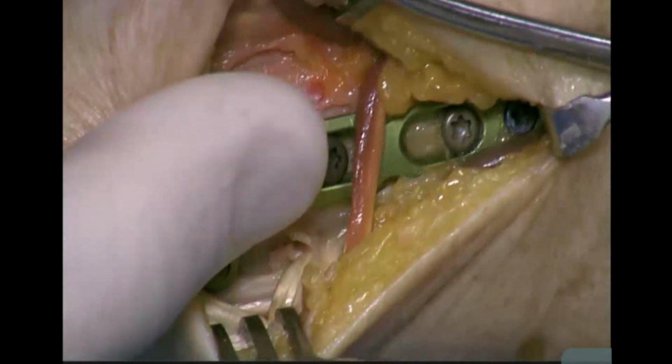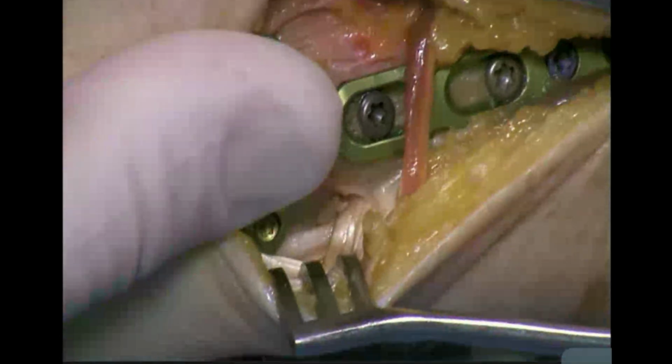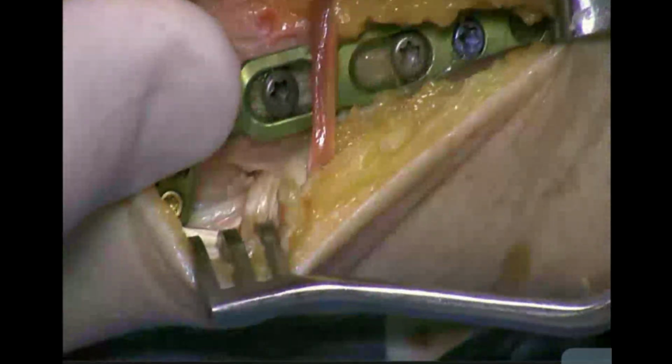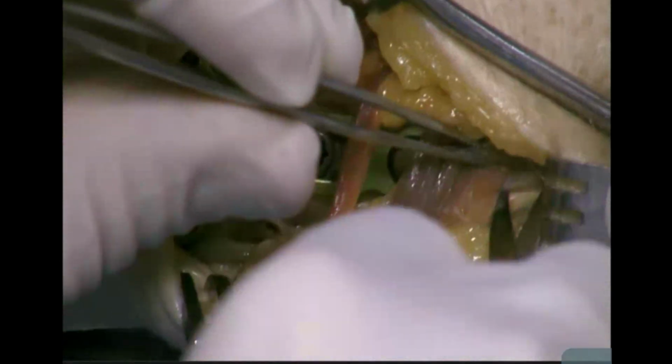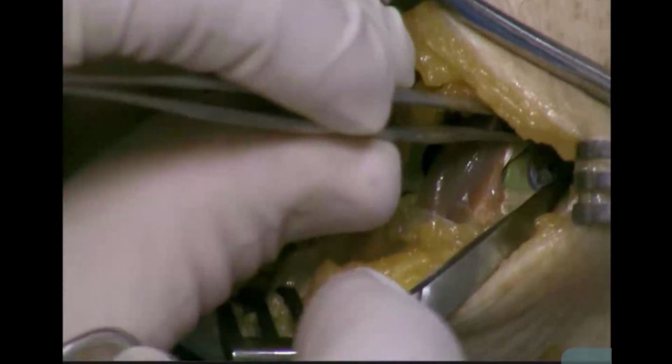And then our choice here is either one more slight pull. That's going to give us access there. And on occasion, we do split between the two muscles of the first dorsal extensor compartment. Now we're between and get back proximally to this last screw hole.